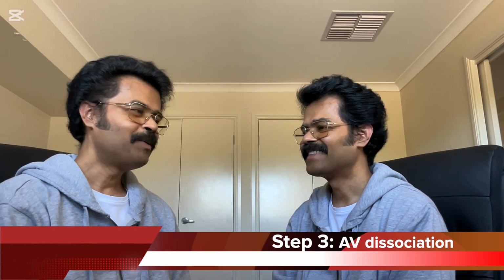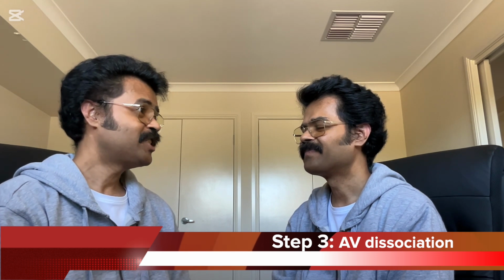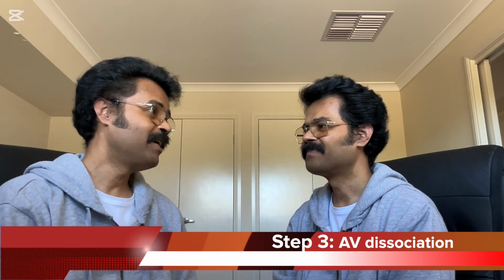So if somebody has got the Brugada sign absent, or in other words, if the RS interval is less than 100 millisecond, we are going to step 3 of the Brugada criteria. So tell us a little bit more about this step 3 of the Brugada criteria and how you will use it in your real life practice.